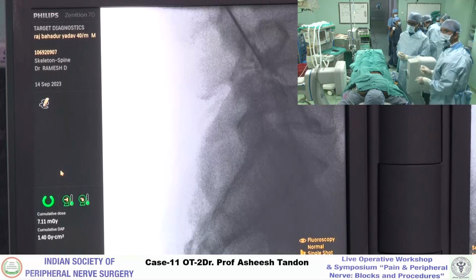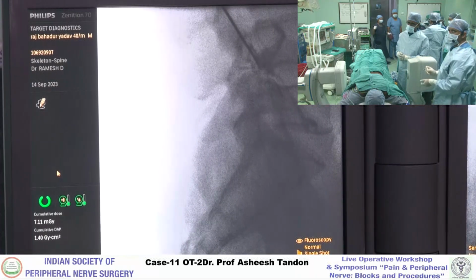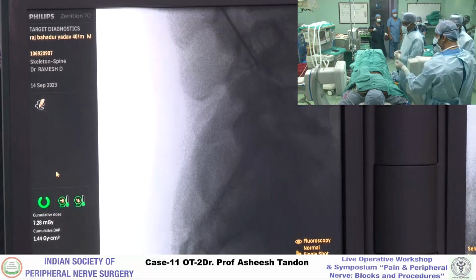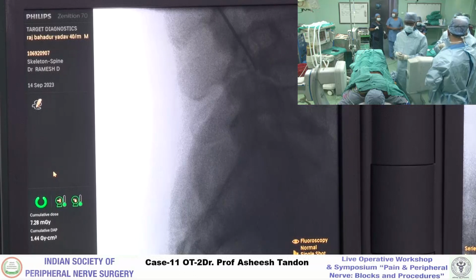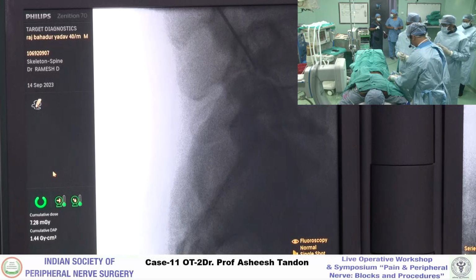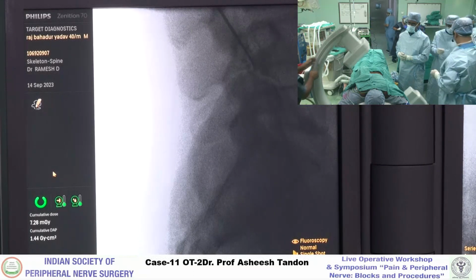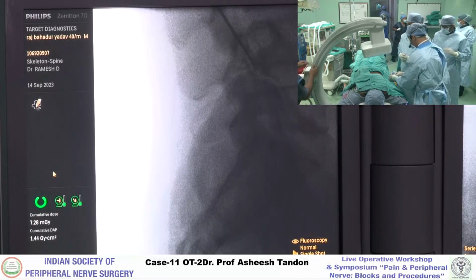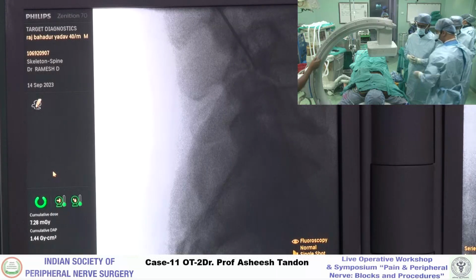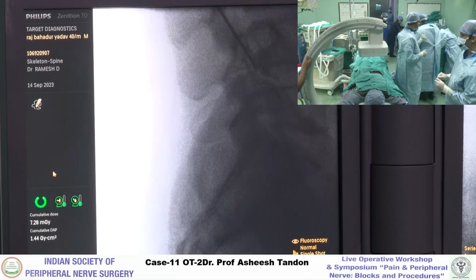So now you're going to do the same solumet, this thing. Dexa. I use Dexa. Shoot, हाँ. Please. Okay, ठीक है. AP कर लो तो AP में और दिख जाएगा. Yeah. So we'll put just half of it. Tilt कर लीजिए.